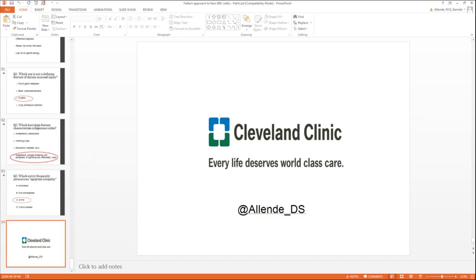Now, talking about this specific differential of IBD versus diverticular disease-associated colitis, as pathologists, because they are only biopsying sometimes the area near the diverticulum and it may have these changes, we have very limited ways to tell them apart. Many times it's impossible. So the distinction requires correlation with the clinical picture.